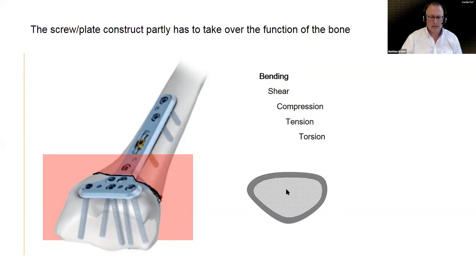The light gray is basically your cancellous bone that you see. Now, if you do a little comparison, obviously, you see, when you put a plate on top to stabilize, this represents the cross-sectional area of metalwork that we put on top of this particular bone. You usually have a cross-section in this region. This is just a rough estimation, so I just calculated this to be a tube with 20 millimeters in diameter.